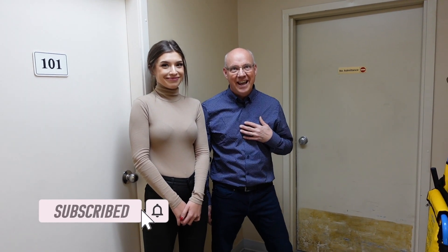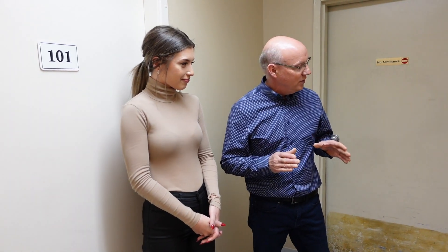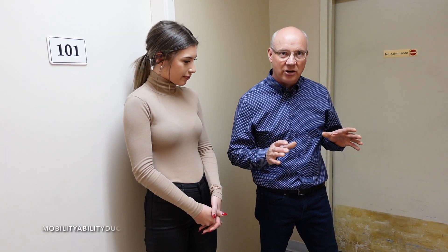Hi, I'm Bills with Mobility Ability, and I'm Cass. We have Kim here as a special guest - we made it to the big screen. Kim has decided to volunteer for us today. So what we're doing today is we're demonstrating EVAC chairs.